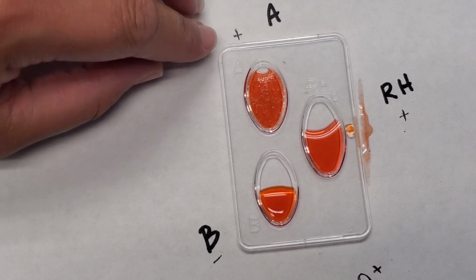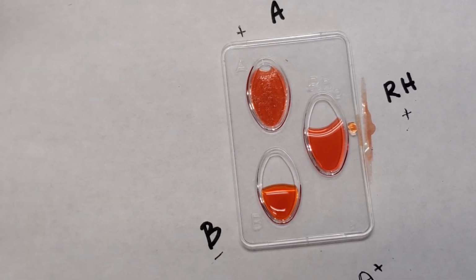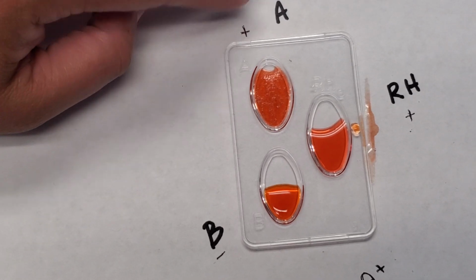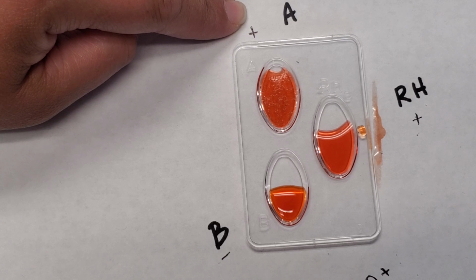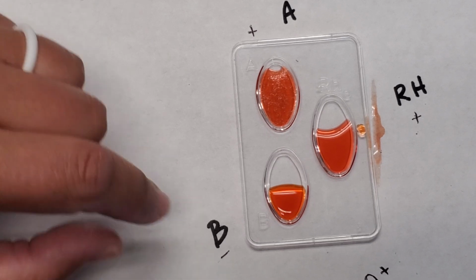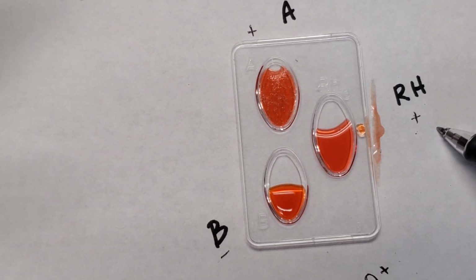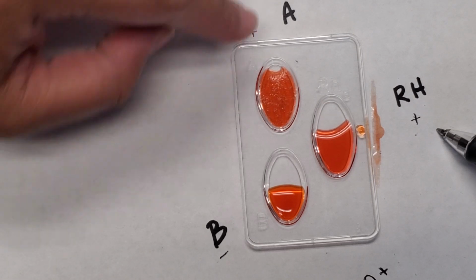So the idea here is wherever you have agglutination, that's the antigen that's present. If it's present, it means it's there. So if you have a positive result in the A well, it means that antigen A is there. If you have a positive result in the B well, that means that antigen B is present. If you have a positive result in Rh, it means that the Rh antigen is there. If you have a negative result, it means it's not there.